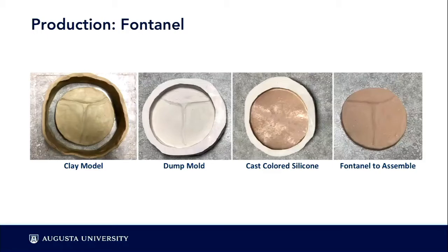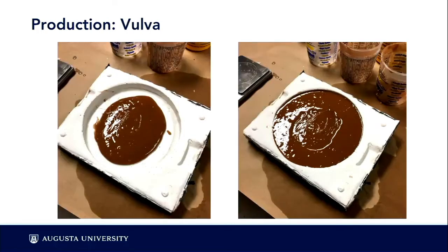I'm going to pass the Chavant clay around so you can feel it — I love this clay for very quick sculpts. You can smooth it with 99% alcohol. We built a wall around the clay model and poured plaster in to create a dump mold — a quick and easy mold-making process — then poured silicone into that shape to cast the fontanelle to insert in the model. The same process was used for the vulva model.